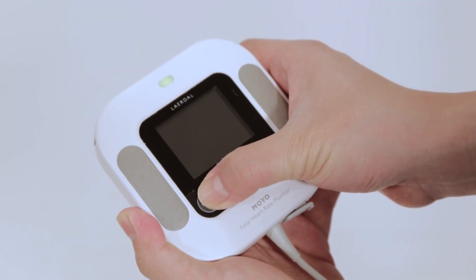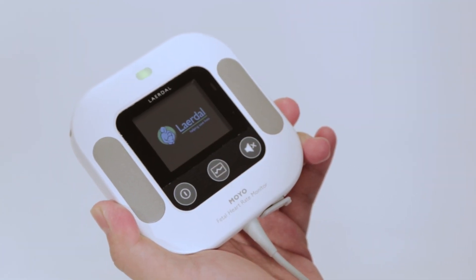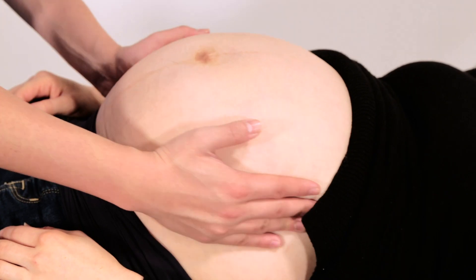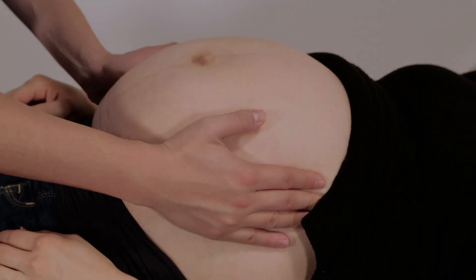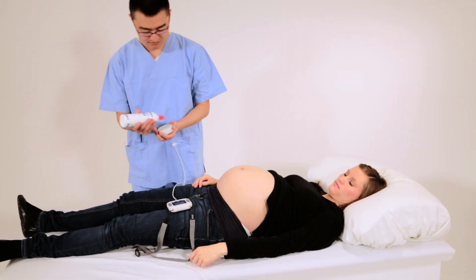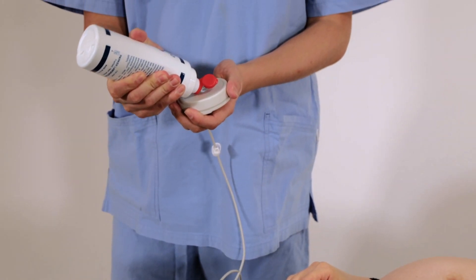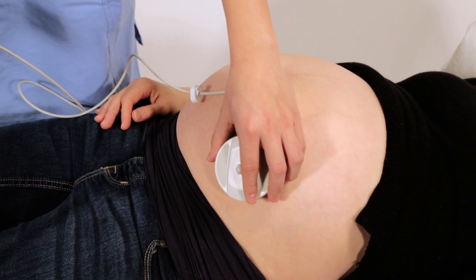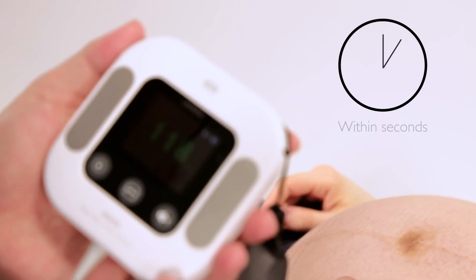Start by turning Moyo on. Palpate to find the position of the fetus. Apply gel to the ultrasound transducer and place it over where the fetus is lying. Once applied, Moyo can detect the fetal heart rate quickly.